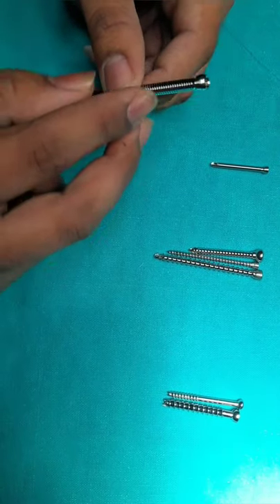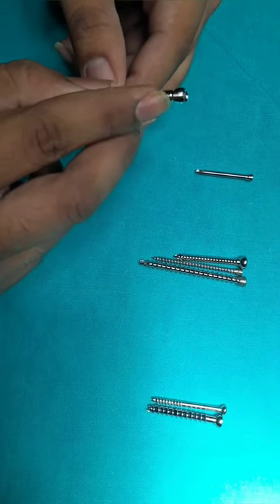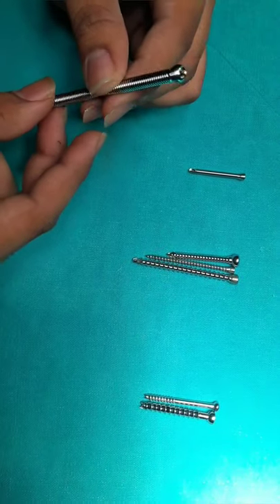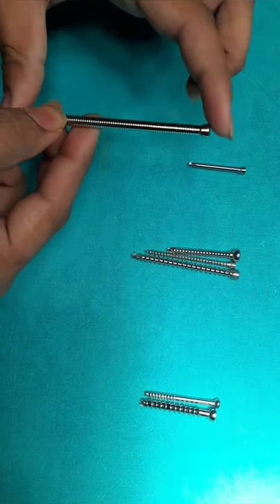Cortical screws have two types of head: this is the locking head and the other is the simple head. Cortical screw size varies according to the bone.